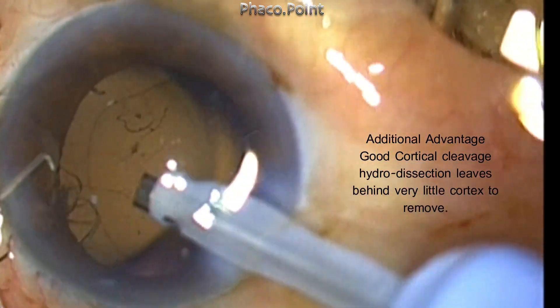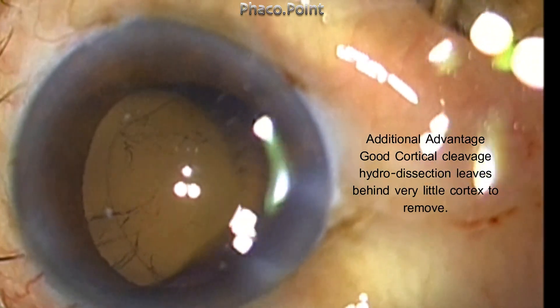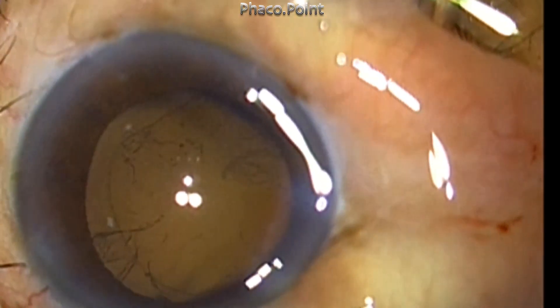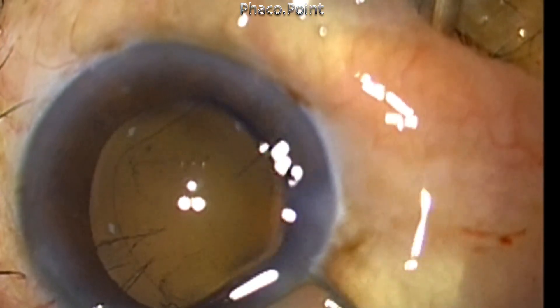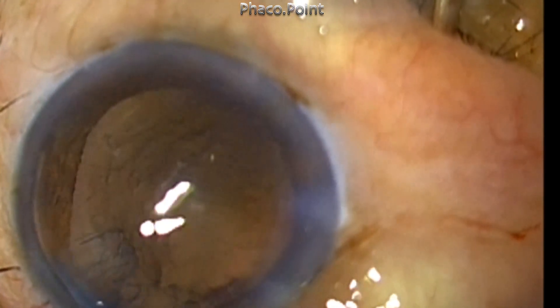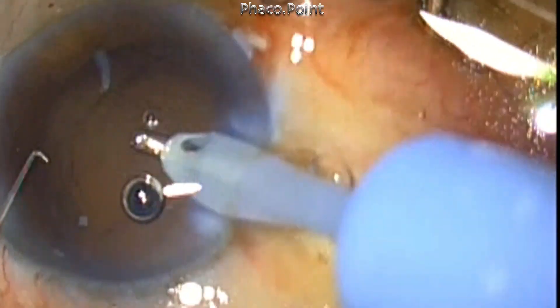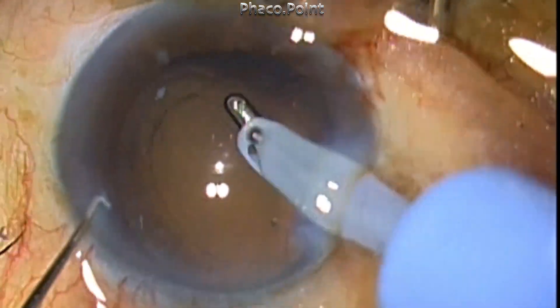In addition, there is a fourth distinct advantage: a good cortical cleavage hydro dissection will enable you to remove the cortex adequately, and very little cortical strands are left behind at the end of the phaco procedure. Therefore, cortical aspiration is also much safer and easier to perform.